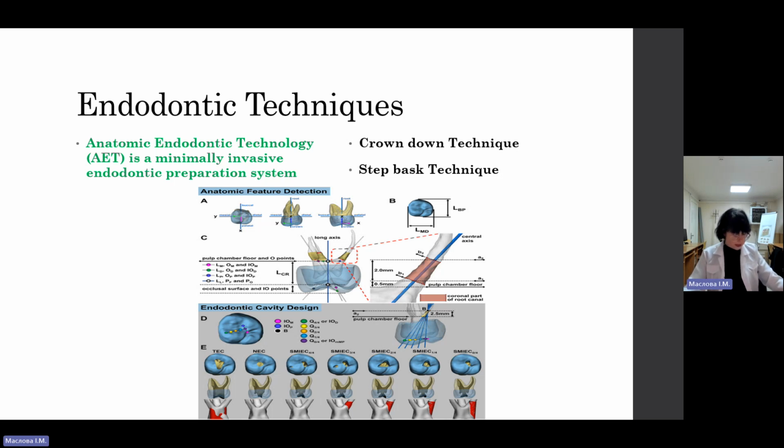The illustrations within this chapter provide examples in increasing levels of difficulty, as well as a description of the hybrid sequence used in each case. The ultimate clinical goal is a predictable treatment outcome with ideal preparation and without procedural errors. In this regard, various types of instruments of various sizes and various techniques are used together in order to combine their advantages and eliminate as many disadvantages as possible.